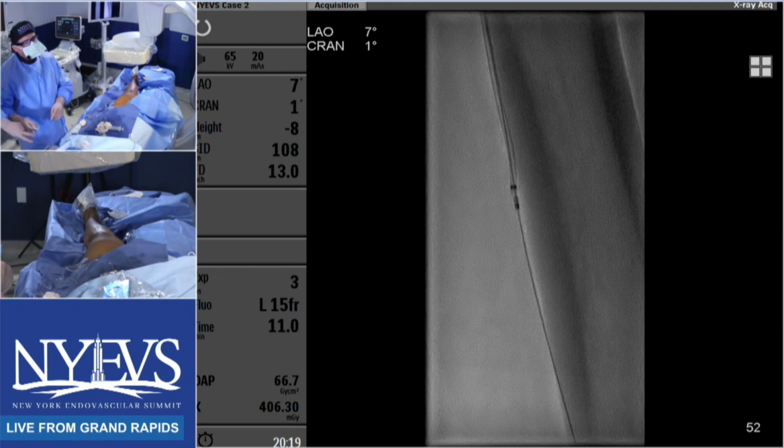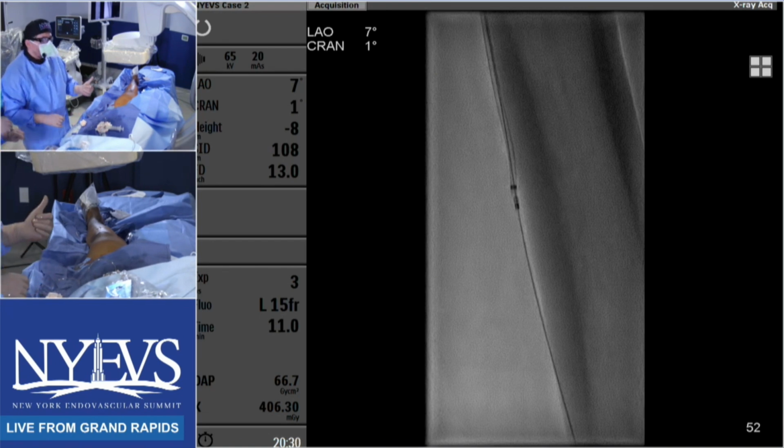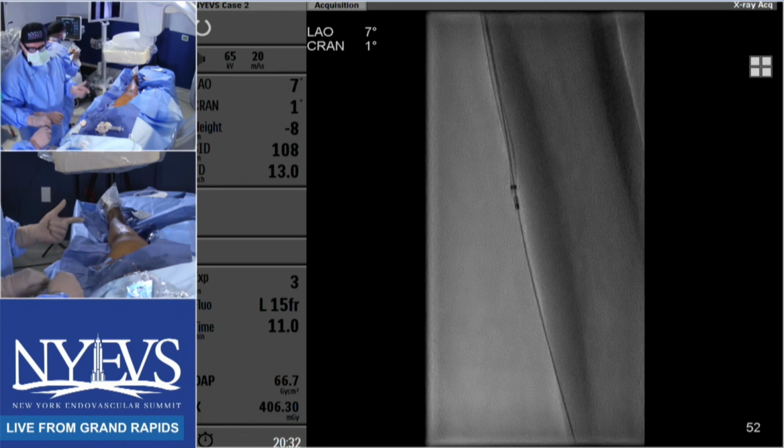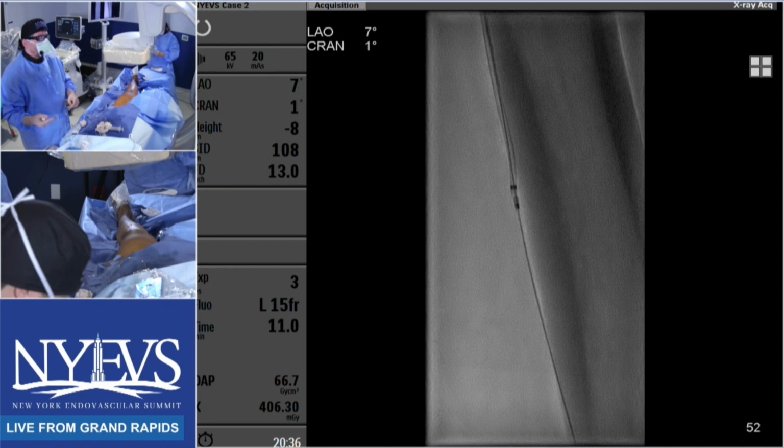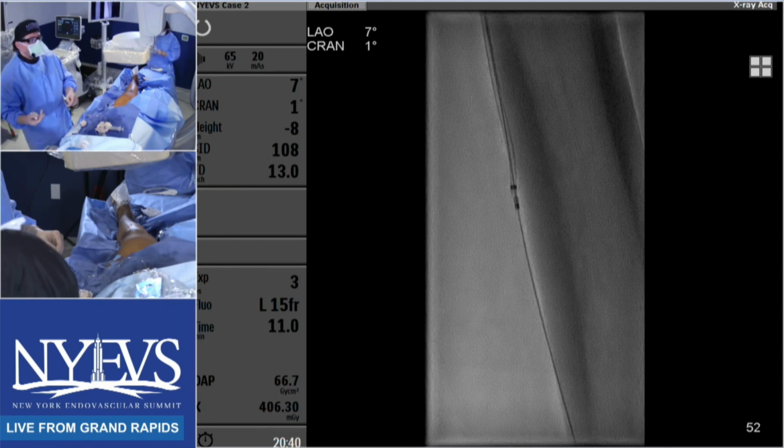Yeah, so this patient, you hit it right on the nail, Serini. This is a pedal loop reconstruction patient, and the data. Let's have the balloon first. The data is if this is an ambulatory patient, a walking patient, a young patient, and you recreate the pedal loop, the data shows that the wound healing rates are up to between 80 to 85%.